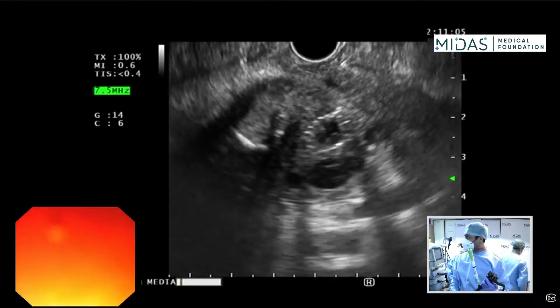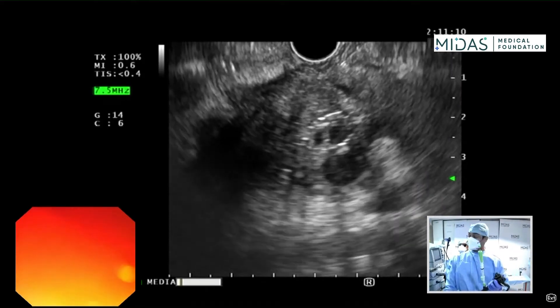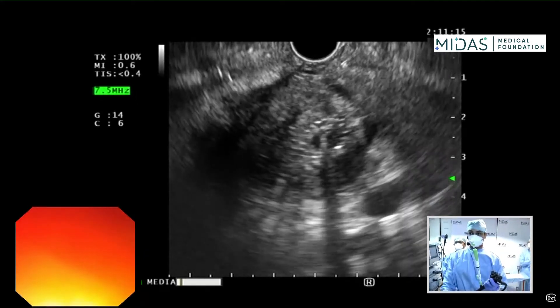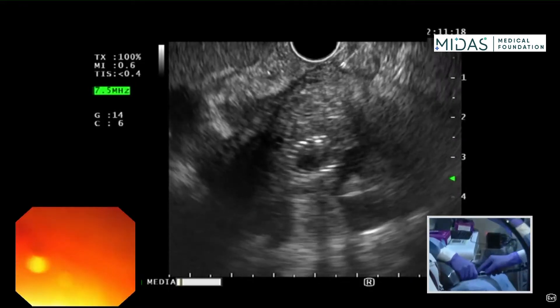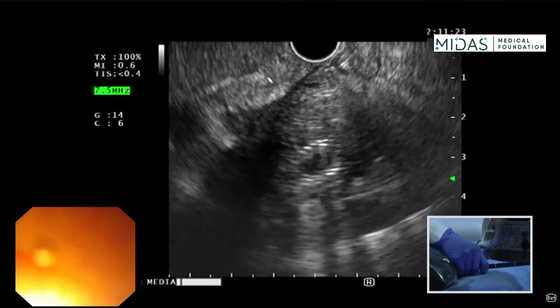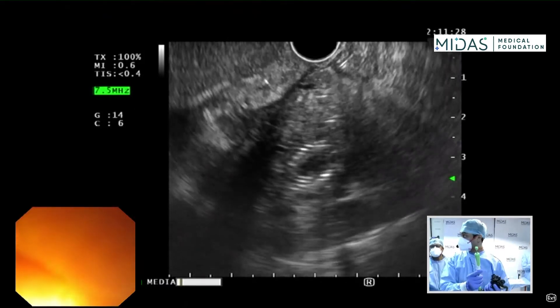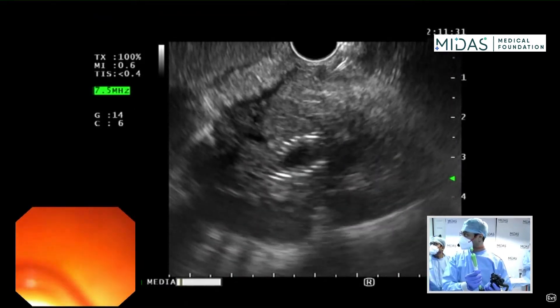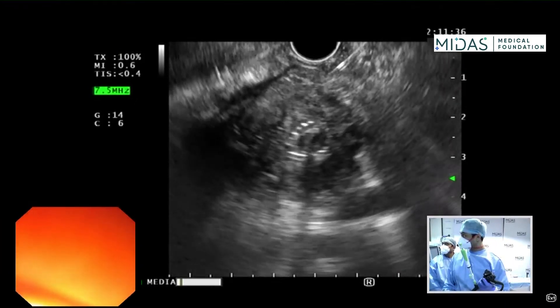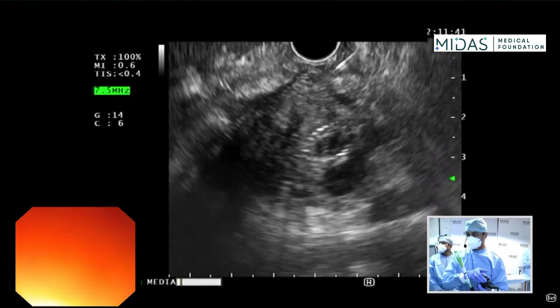I've torqued the scope, so I'm going to ask my assistant to hold the scope for me — you can see how he's holding the scope so that it stays in the torque position as I move my hand away. My assistant is going to hold the scope in position. I'm going to advance my needle gently, but we've lost position — I'm going to torque again and push the scope into the apex of the duodenum.